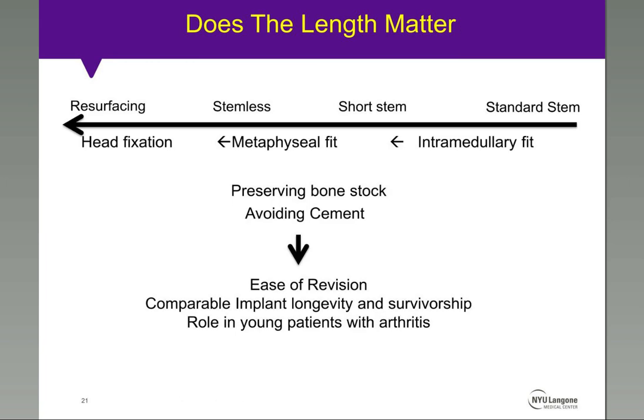As you can see in this slide, as we move from standard stem towards the resurfacing and stemless designs, we are preserving bone stock, we are moving away from the cement. And definitely this would correlate with ease of revision, and short-term and mid-term data is showing that there is comparable implant longevity and survivorship. This would be particularly helpful in young patients with good bone stock, as these designs will allow us a relatively easier humeral-sided future revision surgery.